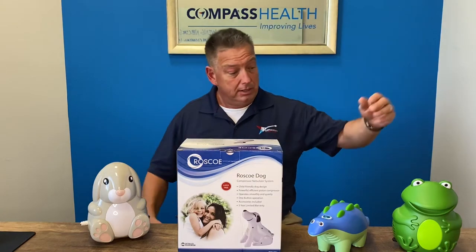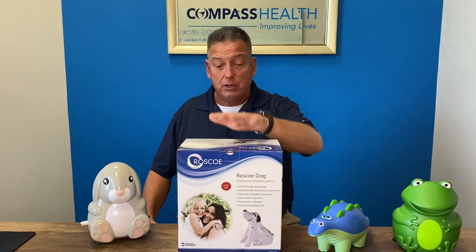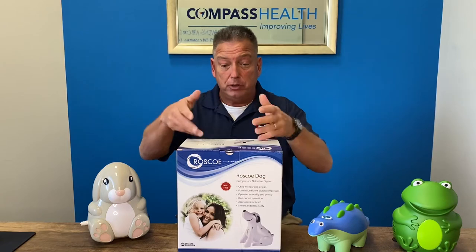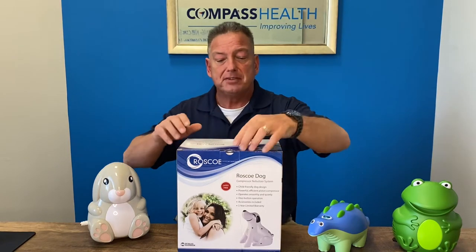Our bunny, our frog, our dinosaur, and the Roscoe dog. And I'm going to go ahead and unbox and show you the dog nebulizer compressor and go through its features and benefits.